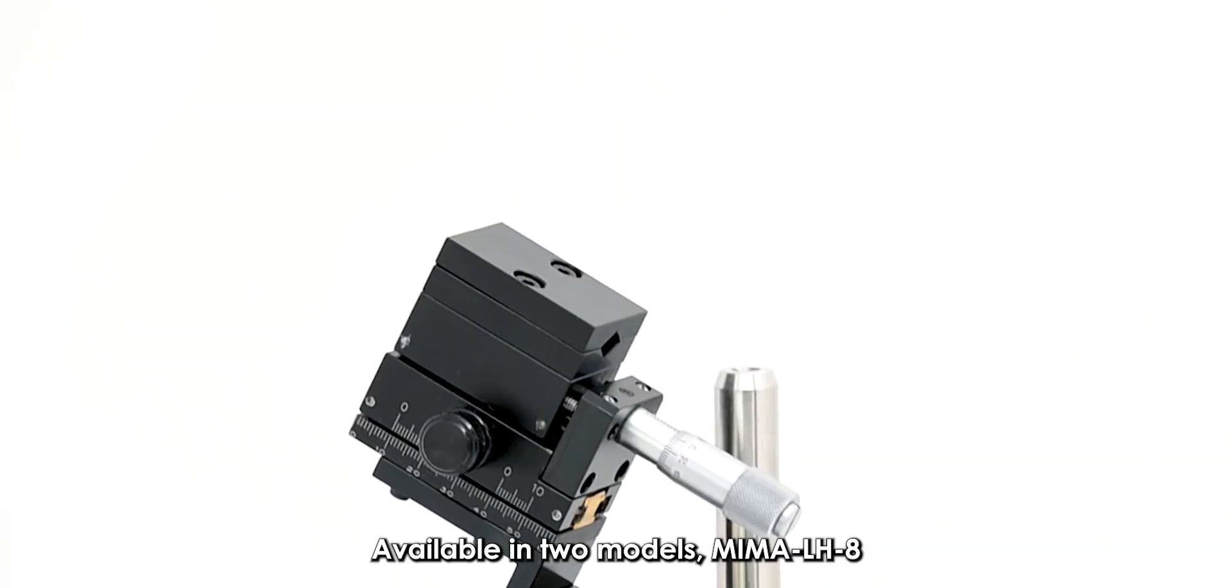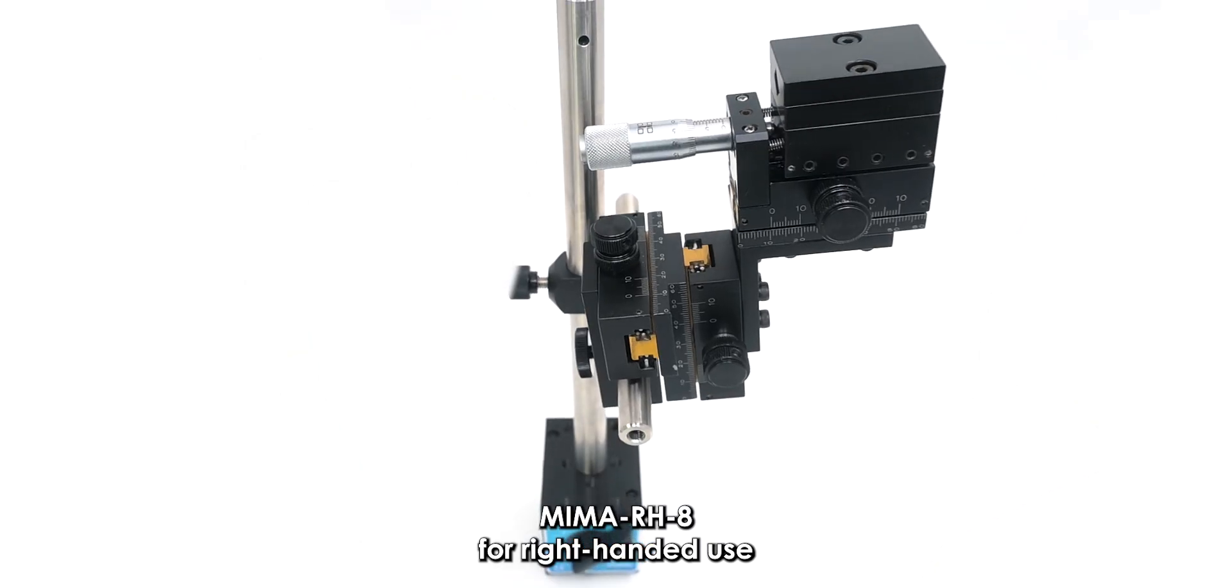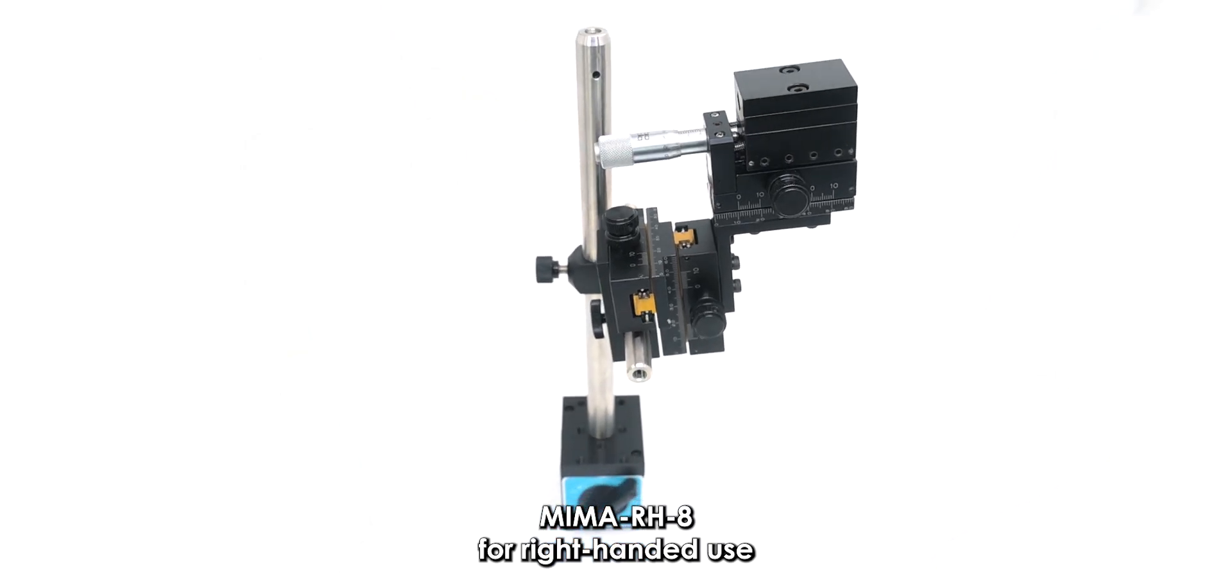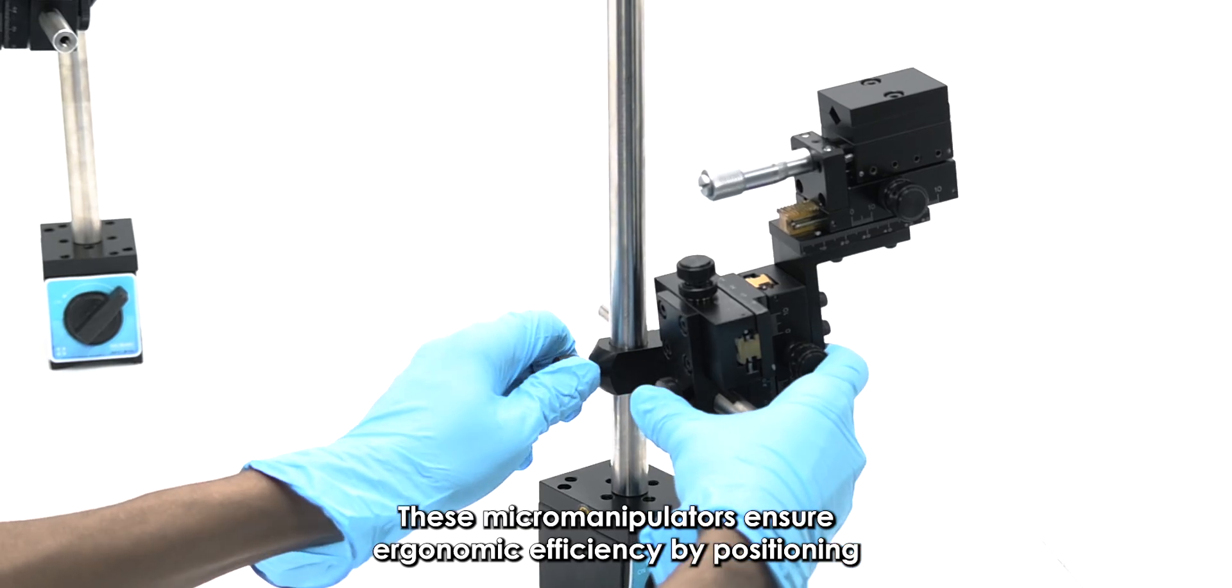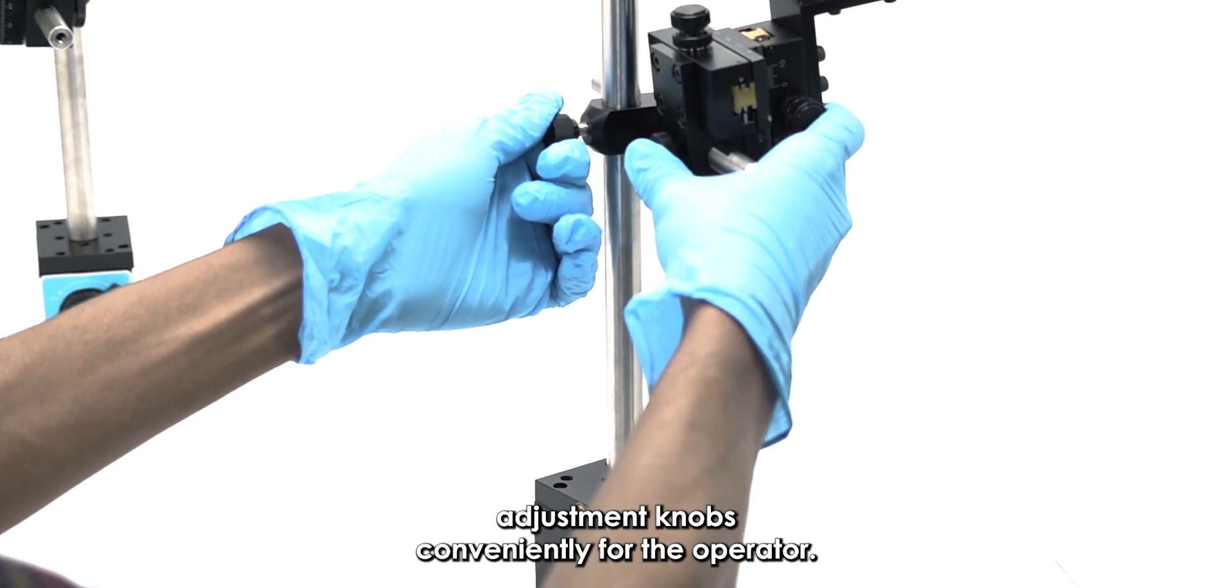Available in two models, MIMA-LH-8 for left-handed use and MIMA-RH-8 for right-hand use, these micro manipulators ensure ergonomic efficiency by positioning adjustment knobs conveniently for the operator.